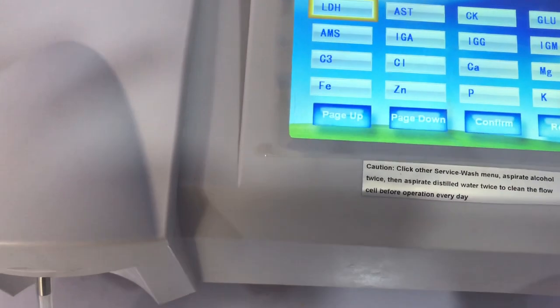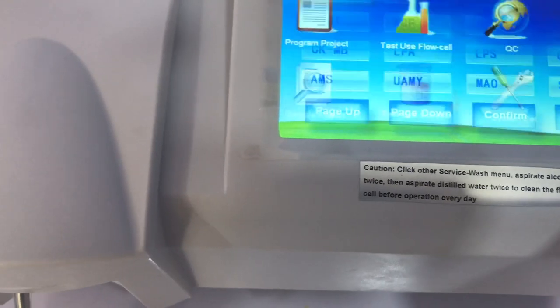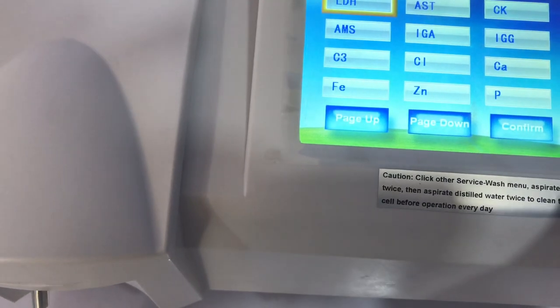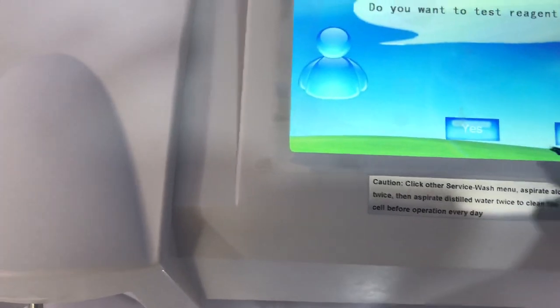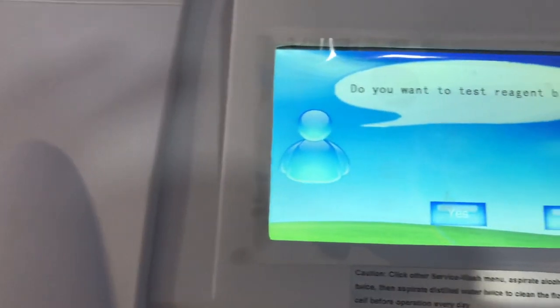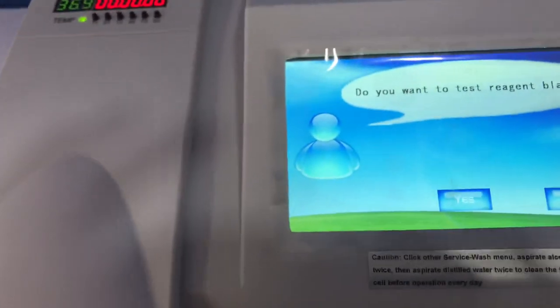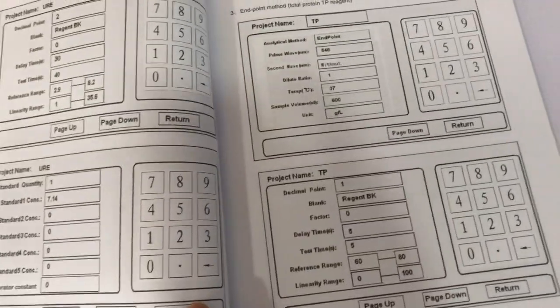Return to the main menu. If you want to run the test, click on the test, find potassium, click on it, confirm, and it will prompt you to test your reagent blank. That's how you go about it for an endpoint method. Now let me show you the other analytical methods.